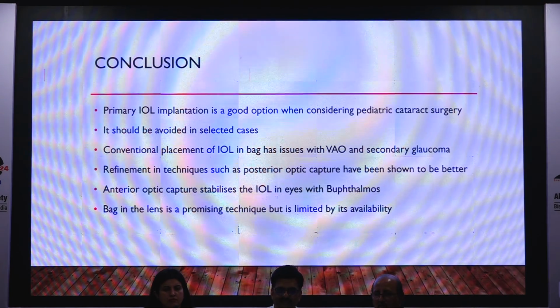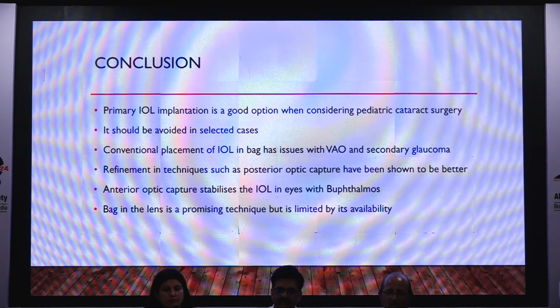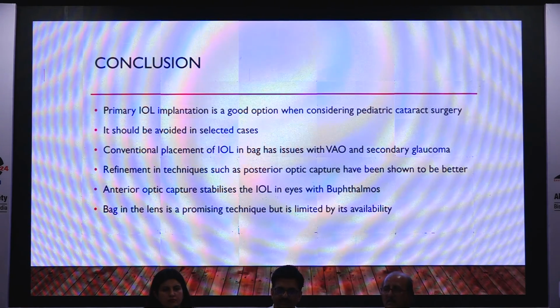So I'd like to conclude by saying that primary IOL implantation is a good option when considering pediatric cataract surgery. It should be avoided in children less than 6 months, and used in selected cases.